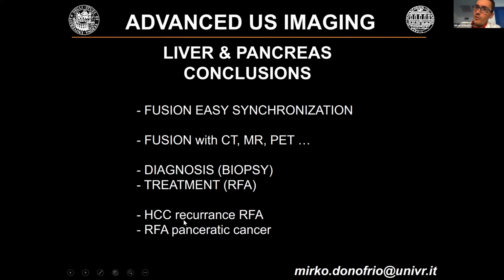But for sure for treatment, yes, and in particular, speaking also about liver, our suggestion is the use of fusion for HCC recurrence, because you treat and retreat this patient, and with CT you can have a more panoramic view of where the new nodule or the recurrence is, and for pancreatic cancer, because you improve your safety for the procedure. Thank you.